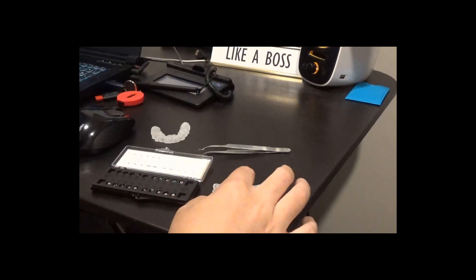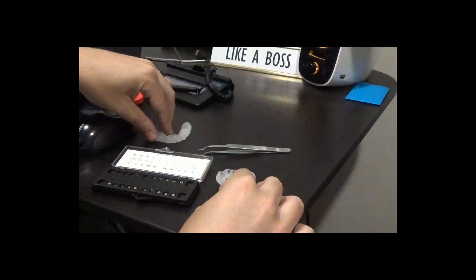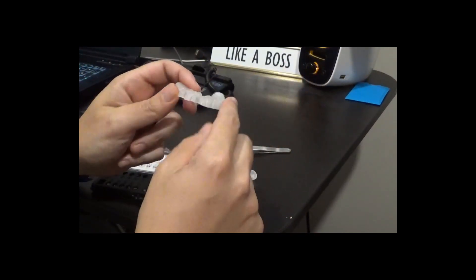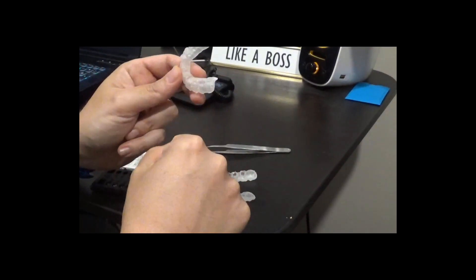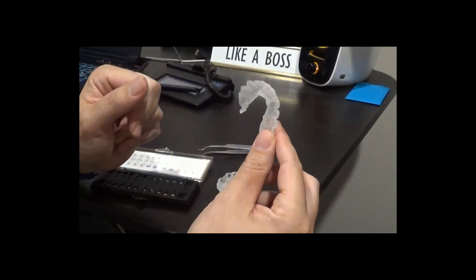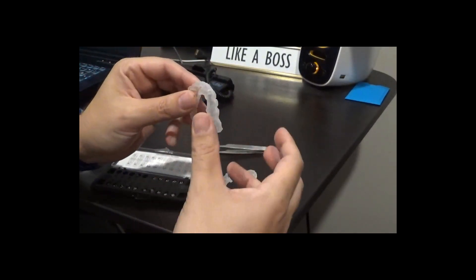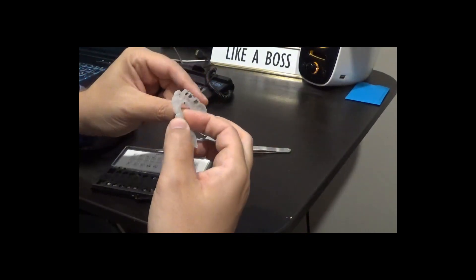Here we are showing the indirect bonding trays after they've been printed, then alcohol bath, then cured, and with the supports cut off of them. That's what they look like — flexible material, but rigid enough that you don't really get a whole lot of unwanted deflection. That's pretty nice.